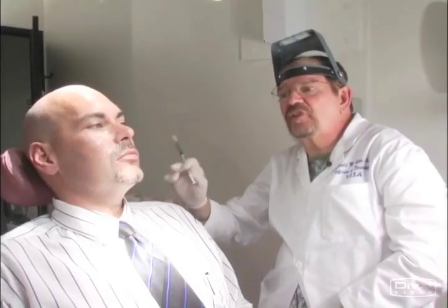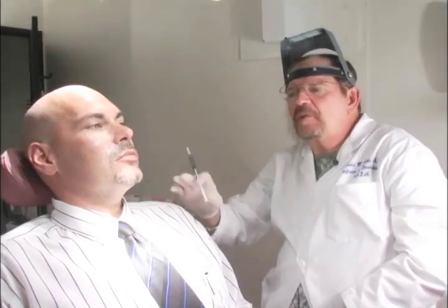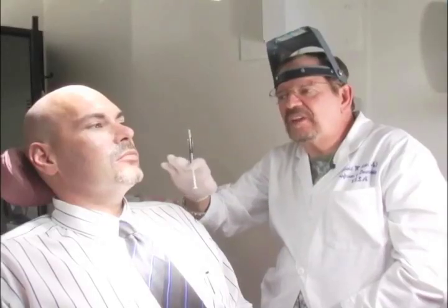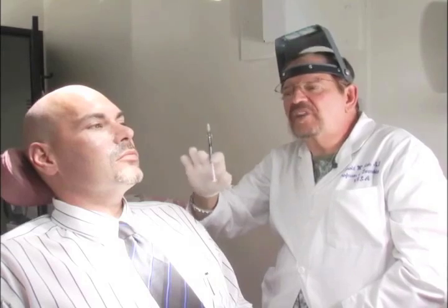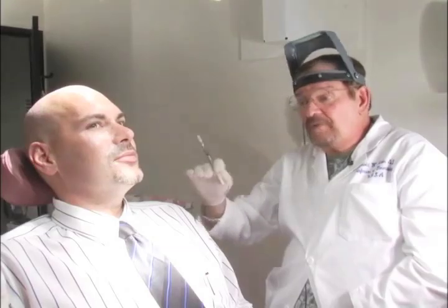So what we want to do is restore the end of his lips, which at the present time are inside his mouth. And we want to restore this dent in the lower third of his face, bring up the corner of his mouth, and do the nasolabial folds up here. By doing that, we should be able to give him a much more rested look. The key thing is not to make people look different, as though they're in an FBI relocation program, but again to make them look better.